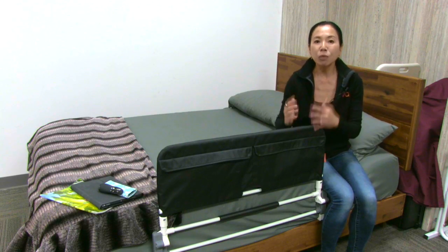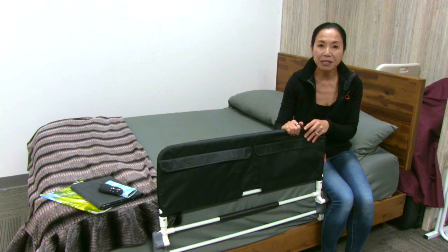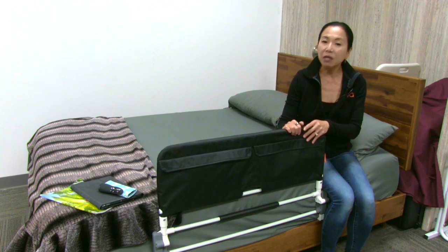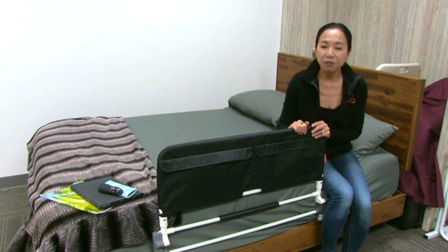But tragically, most people don't think about using a bed rail until after a fall has happened, and many of those falls can really cause serious injuries. So we want to prevent falls in the first place.